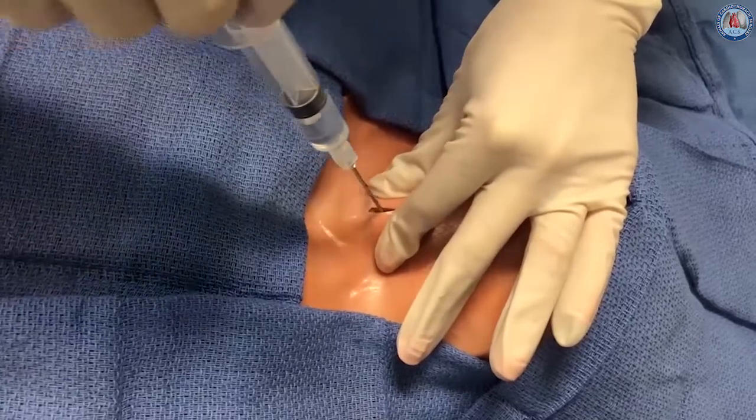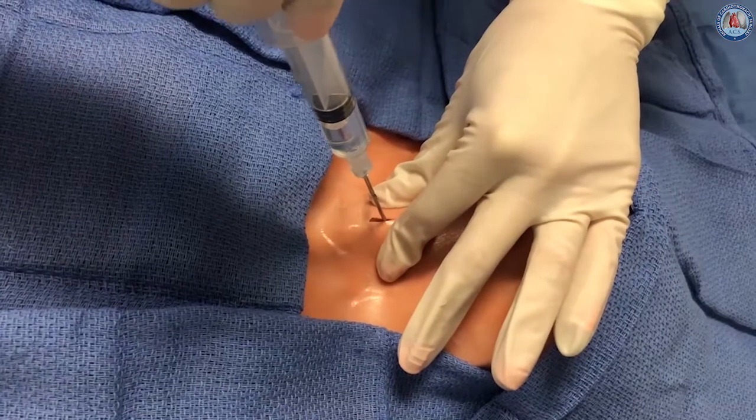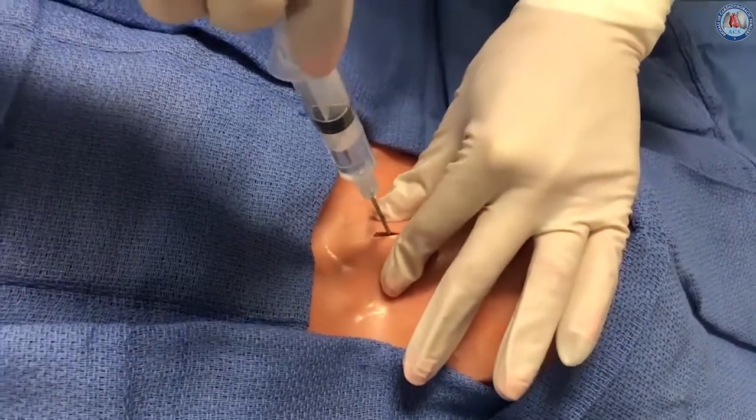The 15 gauge introducer needle on a partially fluid filled syringe is inserted into the trachea with the bevel down and approximately one centimeter caudal to the cricoid cartilage. Tracheal entry is confirmed with aspiration of air and bubbling into the fluid filled syringe.